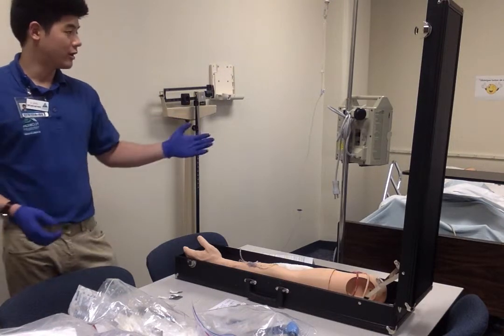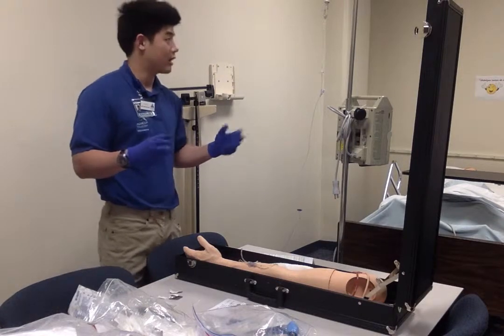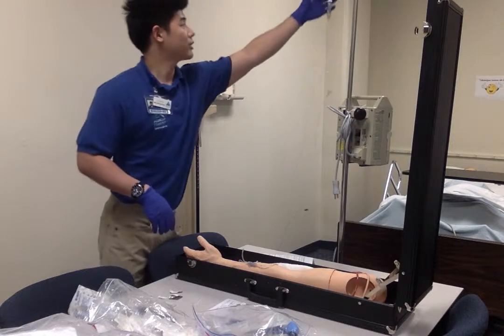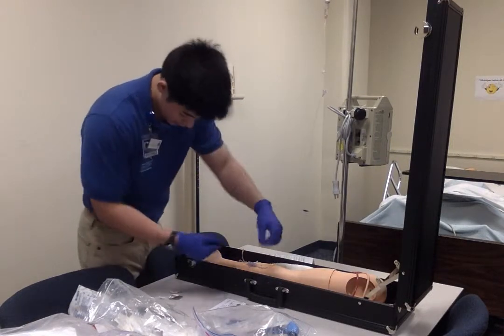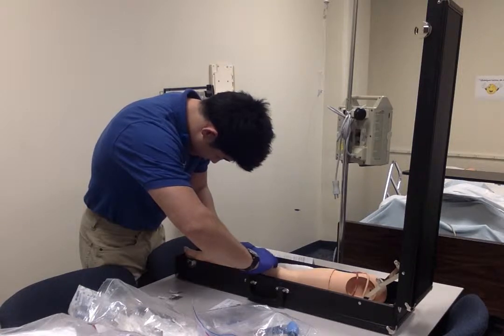And once I'm done, I come back and do my hand hygiene again, put my gloves back on, and make sure this was done, and I'm going to take this off. Alright.